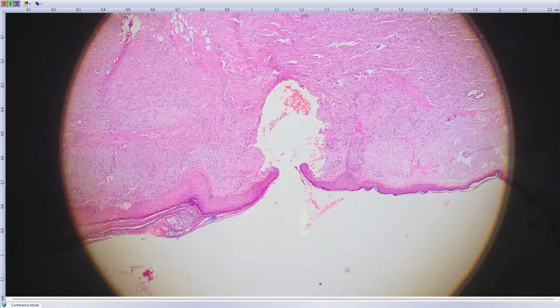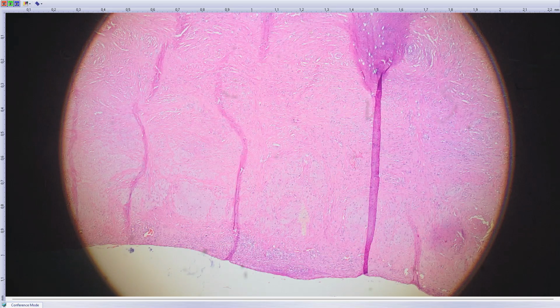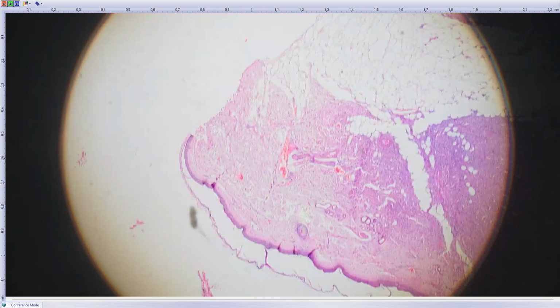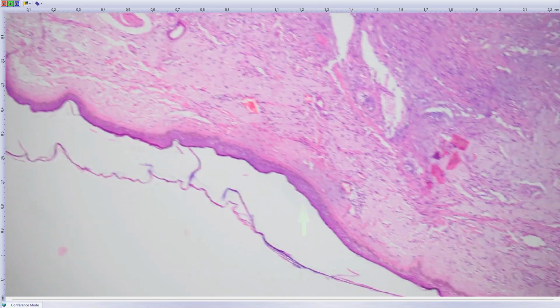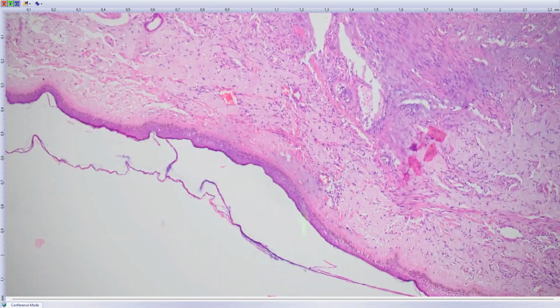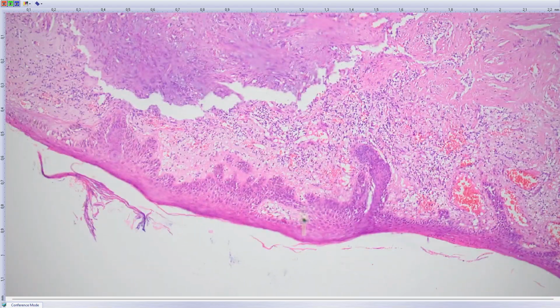And here on the surface is the epidermis, and probably the first thing you notice is this absolutely excessive solar elastosis, which is quite rare to see in this amount. So here solar elastosis, and then when you look around the epidermis, these areas look quite normal, but here it starts to look a little bit funny.